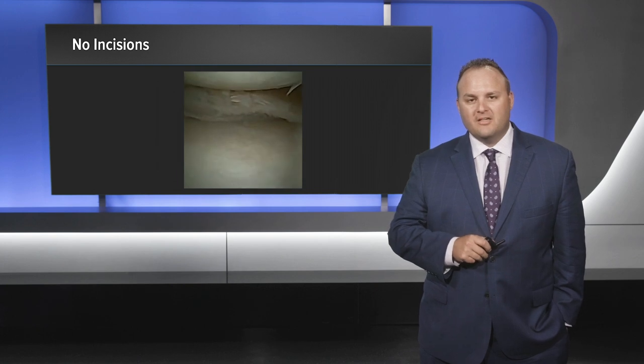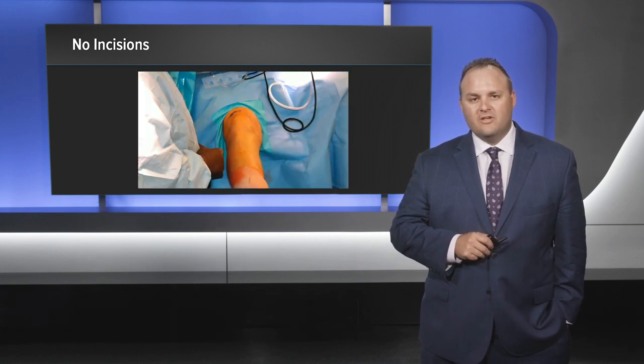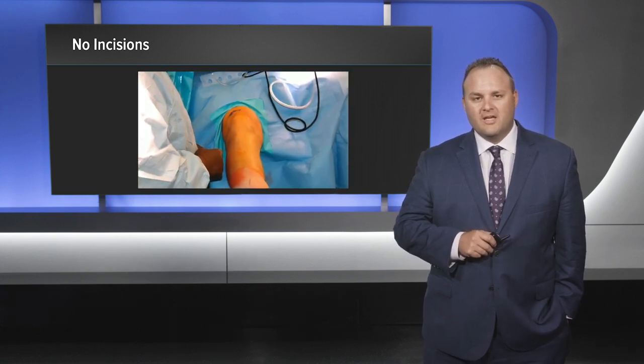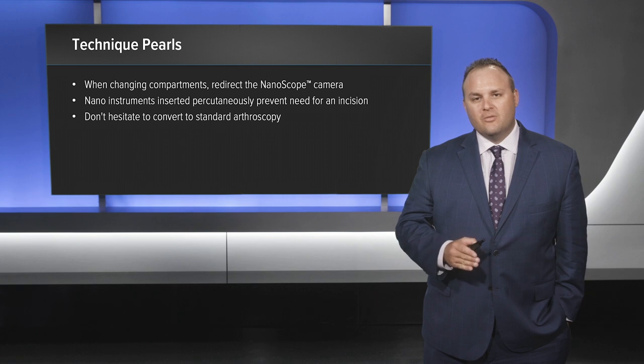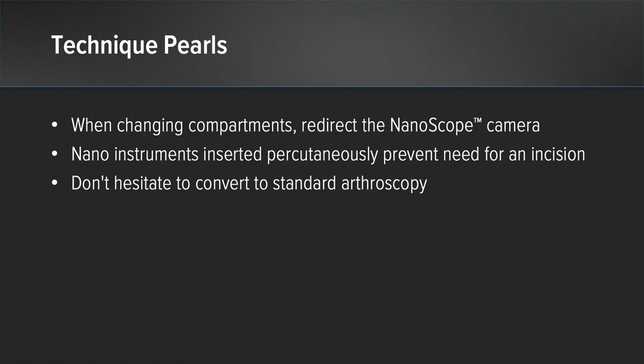The finished partial medial meniscectomy — as you can see, no incisions were made on the knee joint for this case. Some technique pearls: when changing compartments, redirect the nanoscope and nano instruments inserted percutaneously to prevent the need for an incision. And always remember, do not hesitate to convert to a standard arthroscopy.